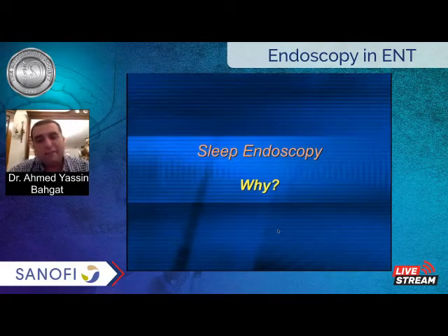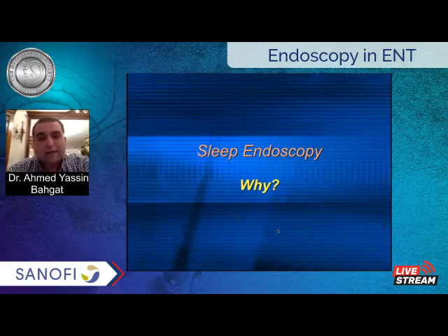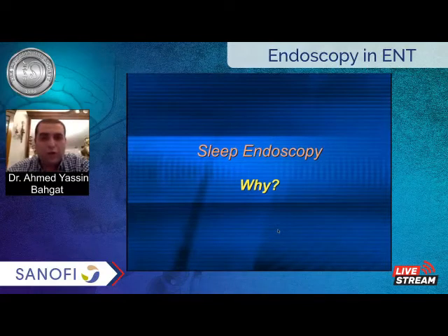Does it really matter to perform sleep endoscopy for such patients? Because many authors now are criticizing sleep endoscopy because it's just waste of time, it's just waste of money, and gives the patient unnecessary drugs. And why? You can examine him while awake and you can do whatever.